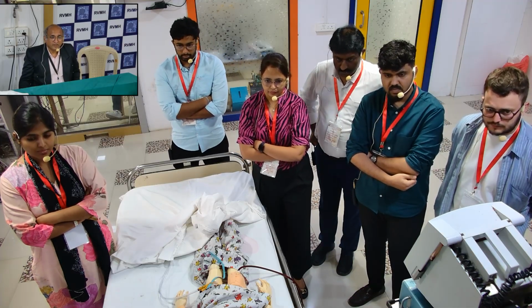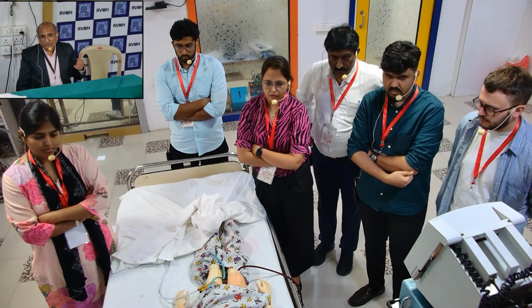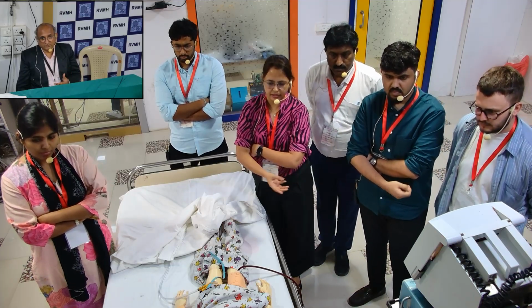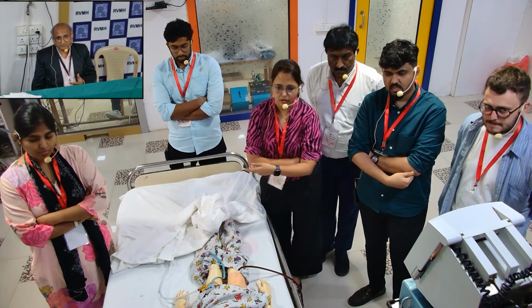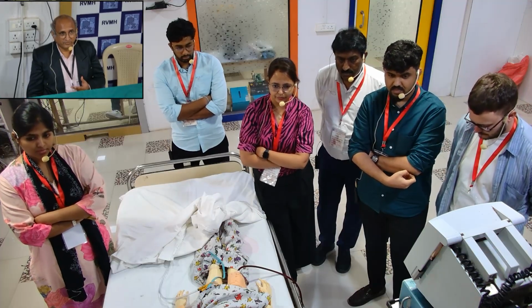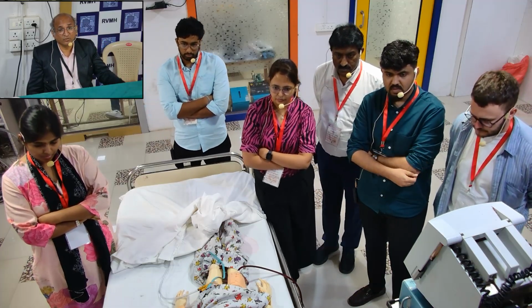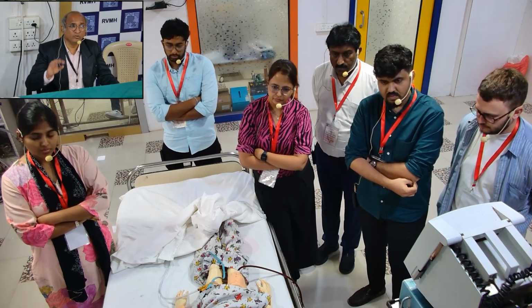Okay. What are the other possibilities which can present similarly? One you said is vessel wall getting the cannula abutting somewhere. We didn't see hypovolemia. We didn't check for any coagulation disturbances. We'll see the ACT, and if the coagulation is a bit disturbed, we will search for any cause for bleeding, and any clot formation in the venous circulation. Another thing is a clot, it can be anywhere in the venous line, or most probably a clot in the venous cannula. A clot in the venous cannula will also mimic something like this, but usually it gives some chattering.